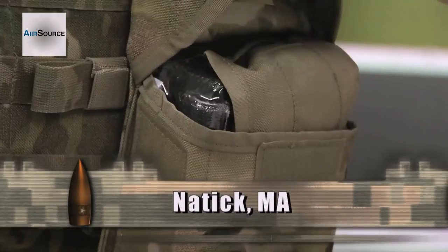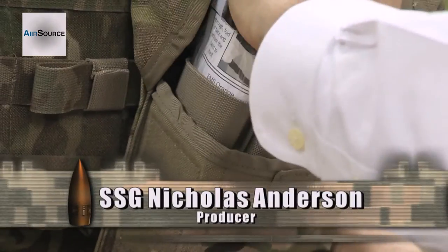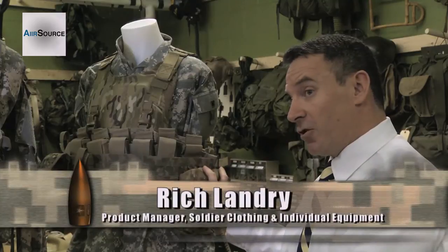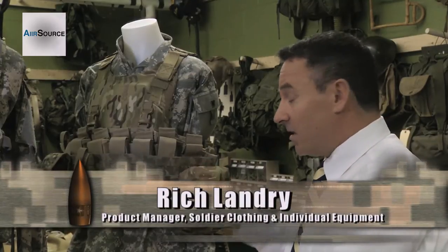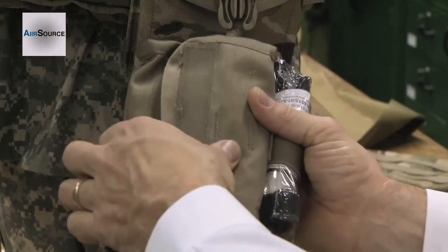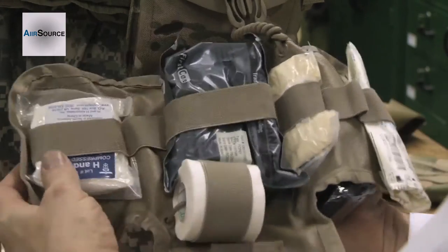We designed this here in 2003 specifically for operations in Iraq. We designed it around an existing pouch because it was a very rapid turnaround — they needed it the next day. So we used an existing SAW gunner pouch and designed an insert to support the items of equipment that the medical community felt was necessary.